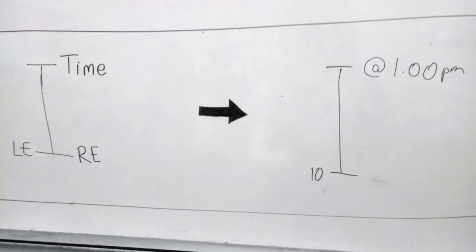The more commonly used method of recording is the I, which stands for I-CARE tonometer. In this case, it is not necessary to write I-CARE next to it. We record the results with the left eye on the left side and the right eye on the right side in order to minimize confusion. It is also important to note that we do not need to write mmHg next to the numbers.